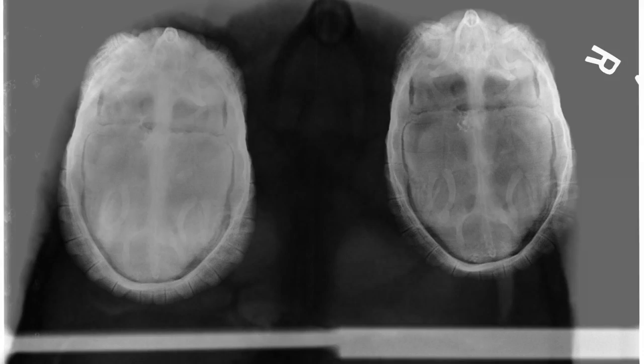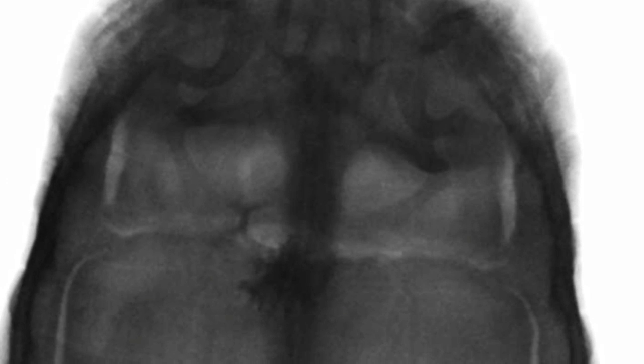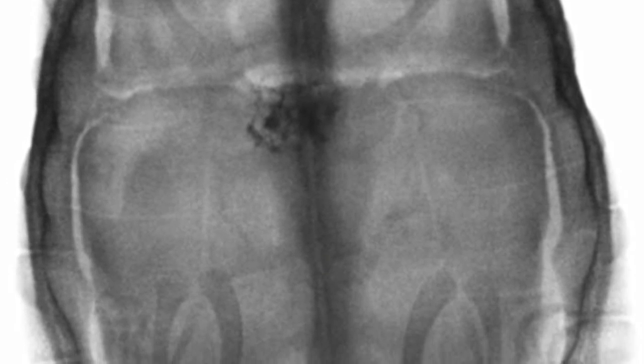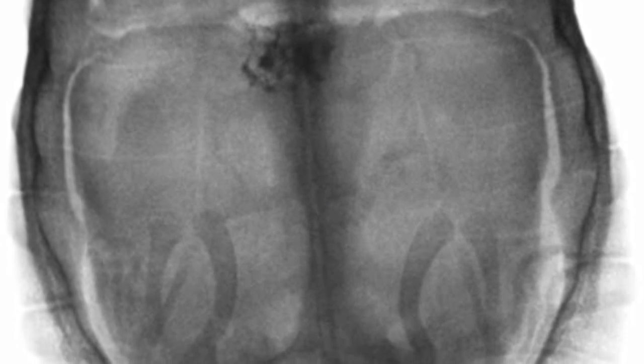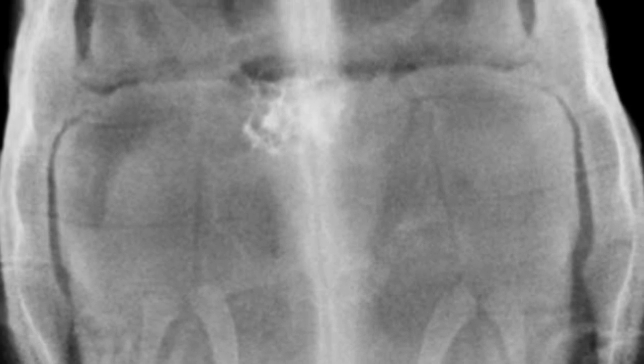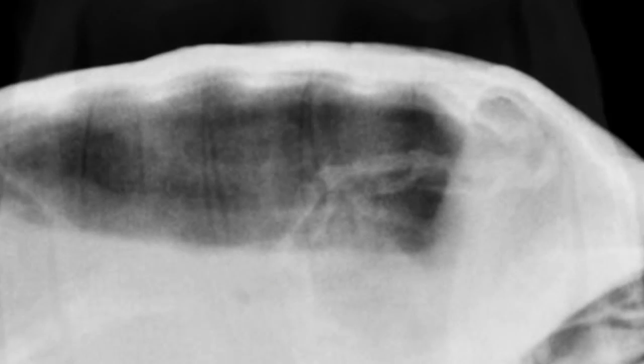Here you can see that little pale area in the middle, and there are some close-ups. This is a negative — that dark area right there at 12 o'clock is the barium insert. The lateral view doesn't show it too much, but I included it to be fair to the radiologist. Here's a good picture — you can actually see it right there in the center, and again at 12 o'clock you can see where the lesion is outlined in white.